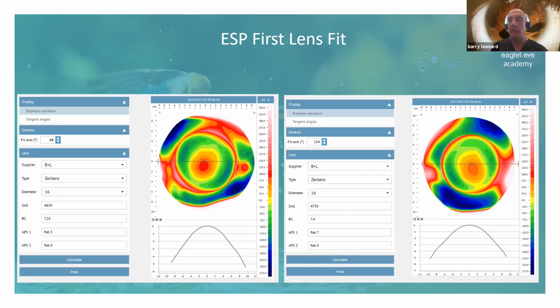So we went to our Zen lens kit to pull out the first lenses. With this case, at the time, I have interns in my office, and this was someone who was doing their contact lens rotation. We discussed this. Her automatic refractor showed like -15 with 5 diopters of cylinder. And so we started having the conversation, well, are we going to do more of a prolate or an oblate fit? Because that's still going to be up to us as a doctor.